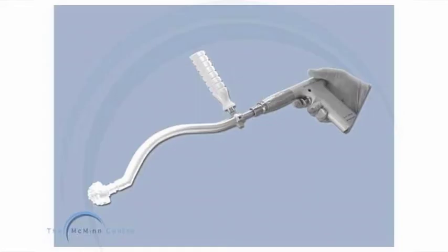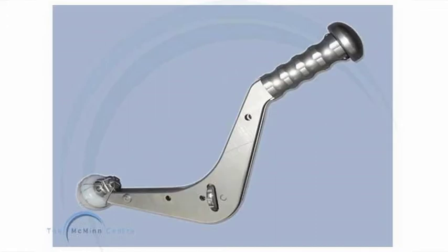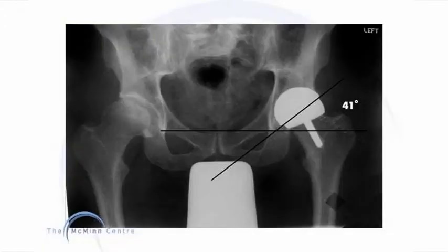Here is a modified new BHR offset acetabular reamer, and this is the new BHR offset acetabular cup introducer. These instruments make it possible to prepare the acetabulum and seat the component through the mini incision. 2D positioning of both femoral head and acetabular components can be measured on plain X-ray. Here we have the method of assessing the inclination angle of the acetabular cup. This angle is 41 degrees. The optimum angle is around 40 to 45 degrees.